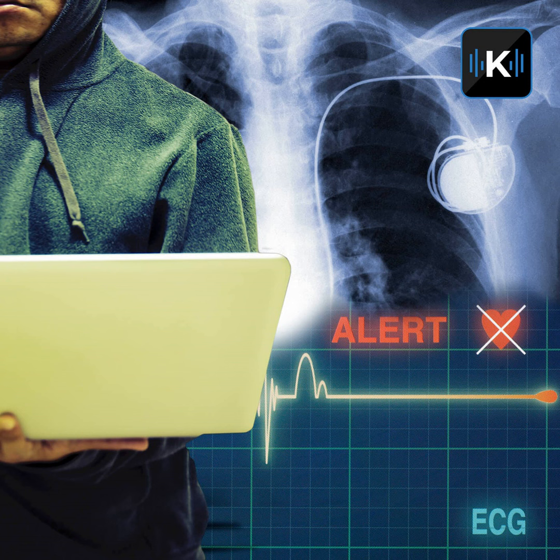One of the reasons is hospitals are pretty much open to the public. Anyone can go to a hospital almost 24/7, and you're not going to be questioned about what you're doing. They'll just assume you're visiting a patient. Because of this openness and all the coming and going, it's easy for an attacker to walk into a hospital. No one's going to really question them, and they can find a communications closet that's unlocked, or an exposed Ethernet network connection, or they could even, for instance, sit in the hospital cafeteria and try to hack into the hospital wireless network.